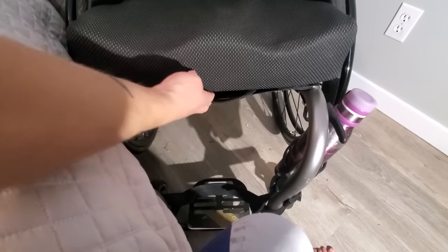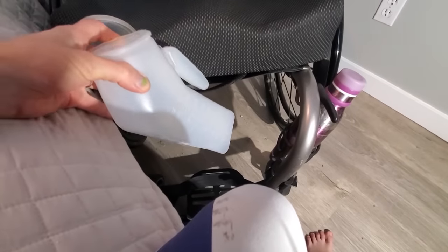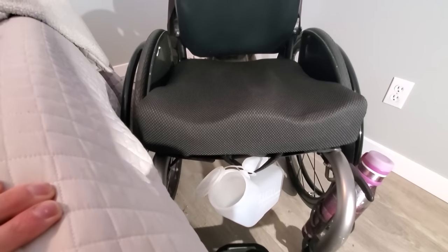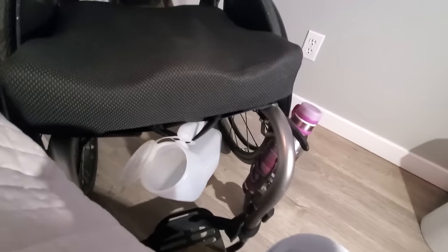Another thing to consider: some cushions have loops or handles at the front edge. For years I actually hung the male urinal on that handle, which is probably why I started using male urinals — they have a handle at the front. But over time the handle on my cushion started to rip from repeated use, so I switched to just holding it with my hands. If you don't have much hand dexterity or struggle to hold both the catheter and the urinal simultaneously, hanging it from a cushion loop is a great option.